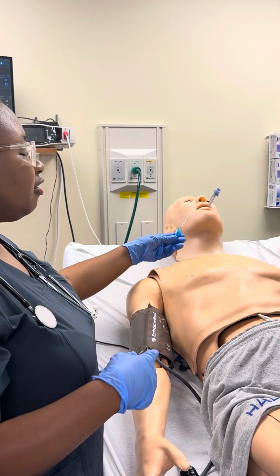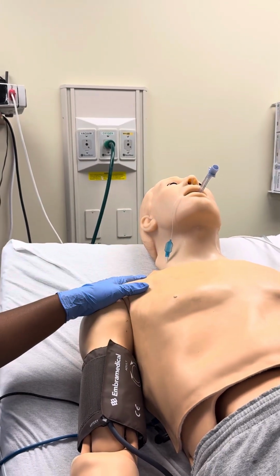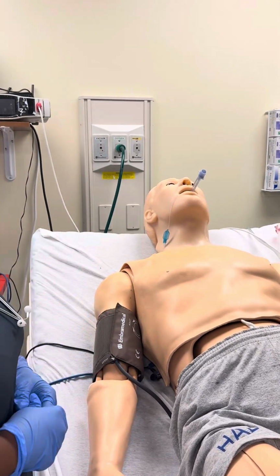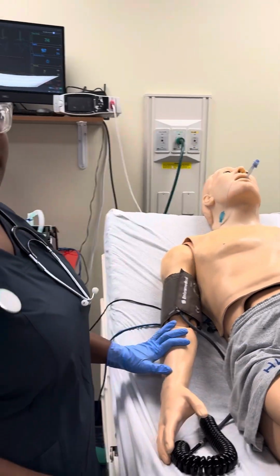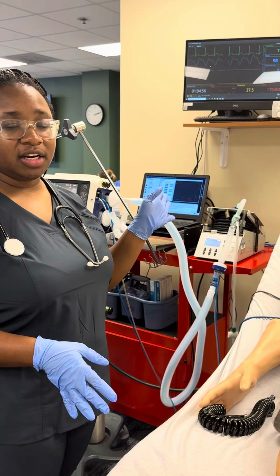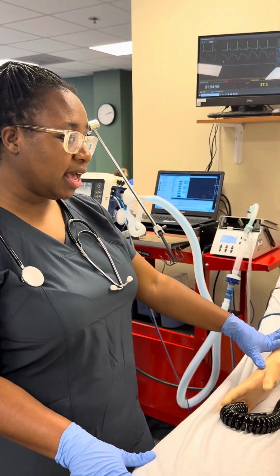Okay, so I checked the cuff pressure, which was 20 to 25 centimeters of water. ETT was secured, and I ordered a chest x-ray and confirmed that it's in the right place. I did obtain the ABG 30 minutes after the patient was placed on mechanical ventilation. We did need to correct the patient's acid-base balance.